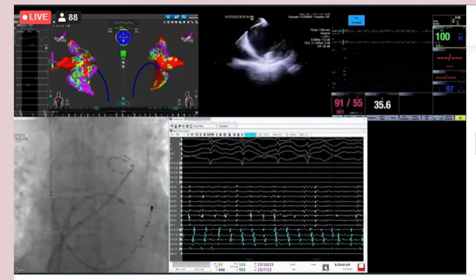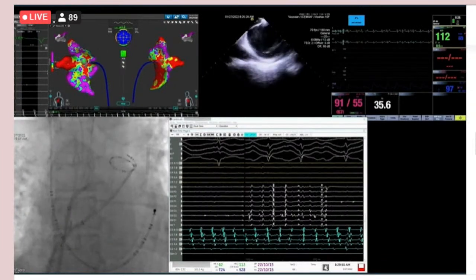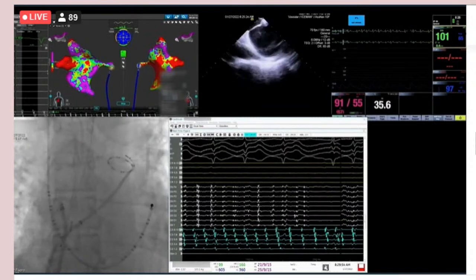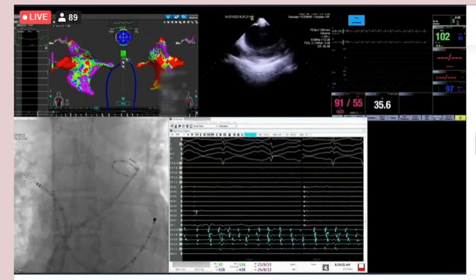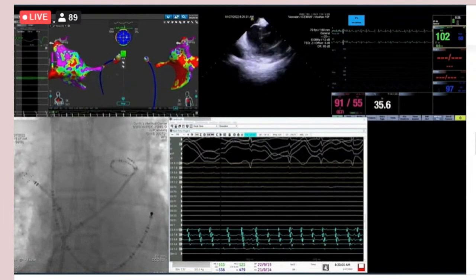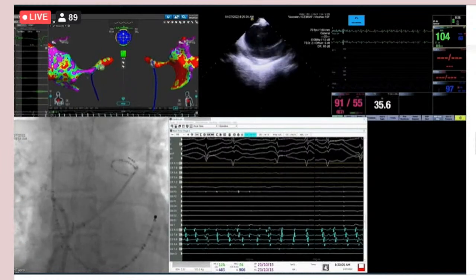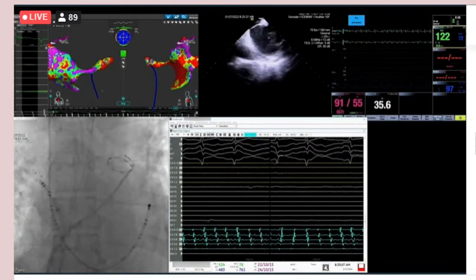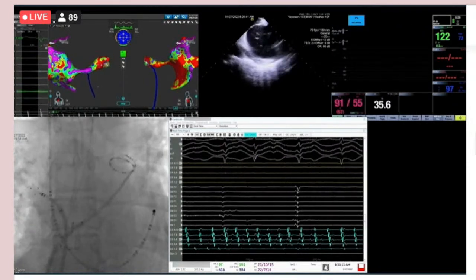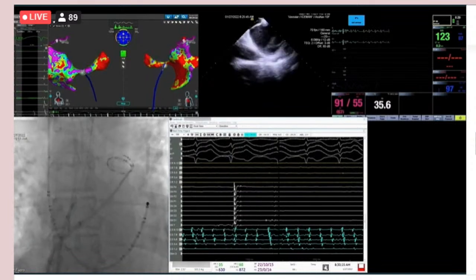The catheter itself handles very well, very similar to standard catheters. It's not remarkably stiff, doesn't have a lot of limitation, and it's bidirectional, which is probably the only thing I don't particularly like about it. I like unidirectional catheters. But even considering that, I was able to pretty much get everything else that I wanted throughout the whole case. This was, I think, my first case using this, and overall, I think things went very well.